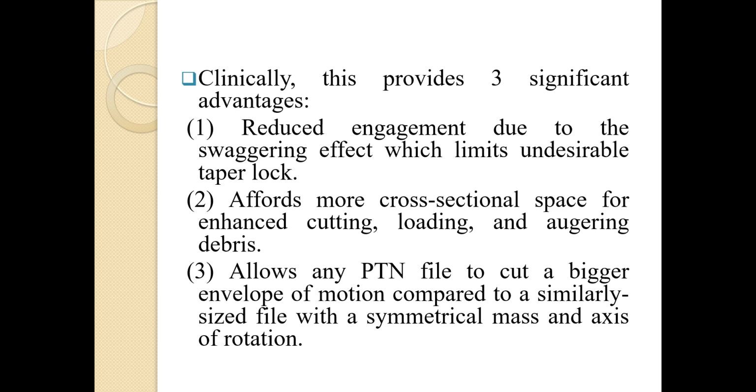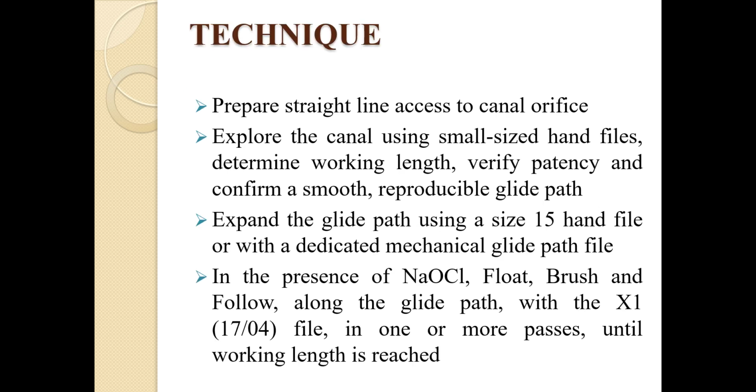One, reduced engagement due to the swaggering effect, which limits undesirable taper lock. Second, it offers more cross-sectional space for enhanced cutting, loading, and removing the debris. Third, it allows any PTN file to cut a bigger envelope of motion compared to a similarly sized file with a symmetrical mass and axis of rotation.